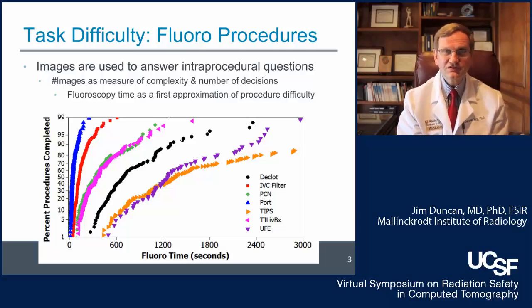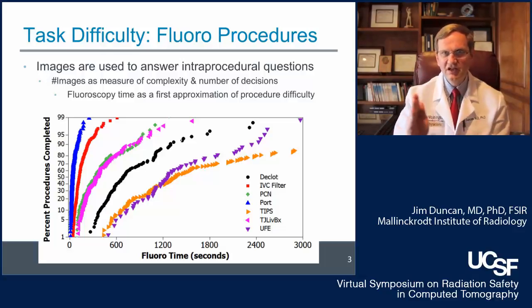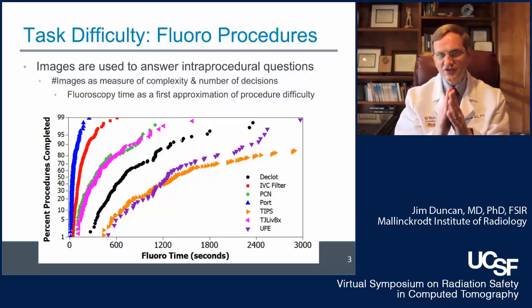IVC filters, series of additional questions that come up during the procedure, and that requires additional fluoroscopy images. For PCNs and transjugular liver biopsies, a little bit more complicated.